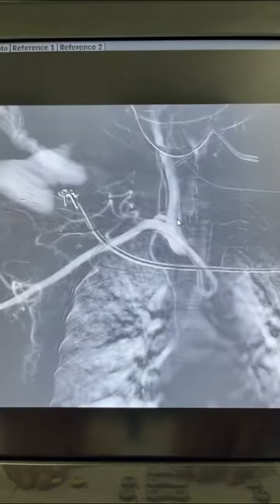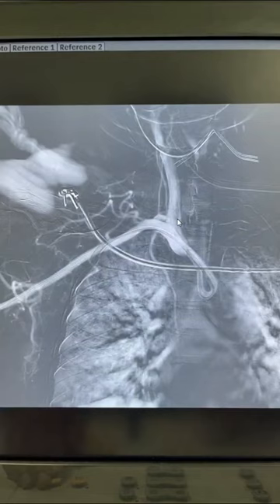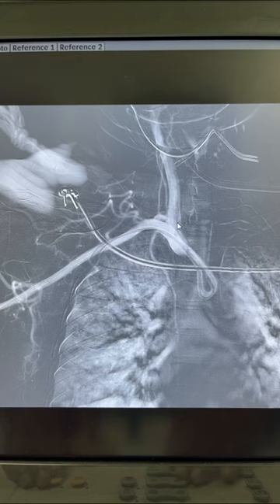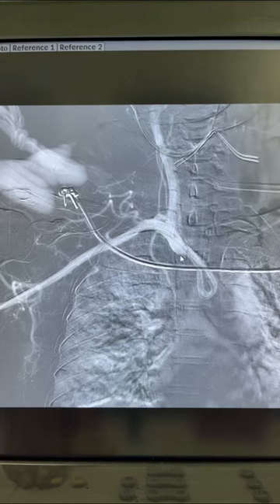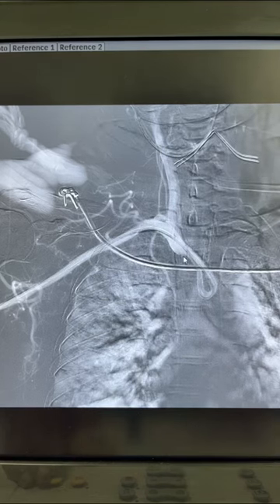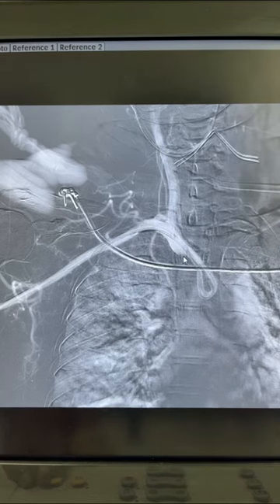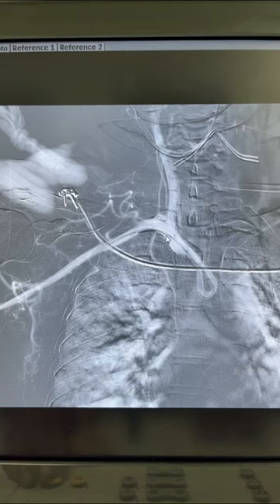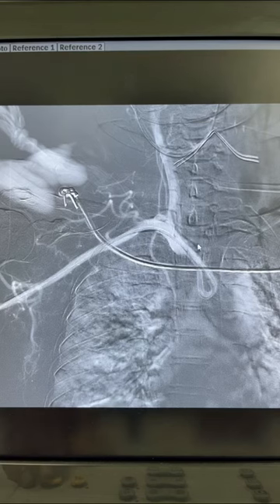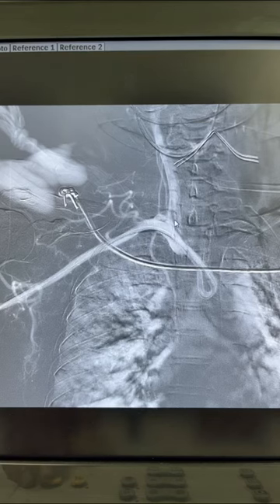The ideal approach is to take a road map like this. Once you take the road map, you can clearly see the right common carotid artery. Once you identify the common carotid artery, just flip the catheter so that the curve is pointing upwards like this.